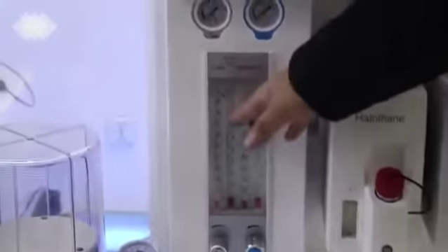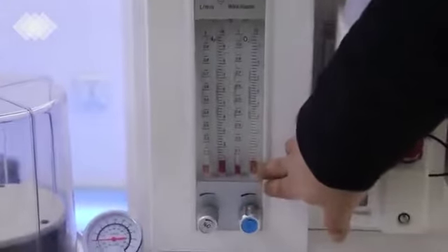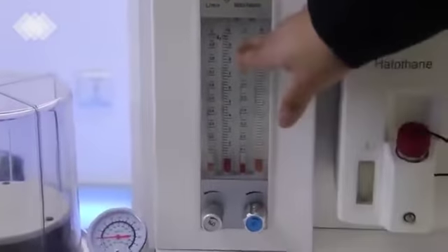And here we see the flow meters. You can see, as I mentioned, we can choose the oxygen, we must have it. For the nitrous oxide, we can change it to air. But no matter which gas source, there are two tubes for each. And you can see each one is from 0.1 to 1 and also 1 to 10. It ensures you can set the parameters very accurately.